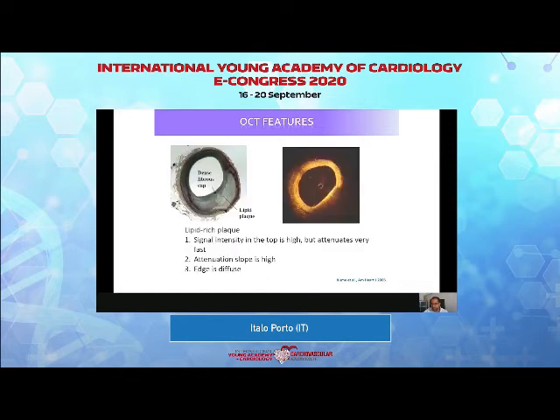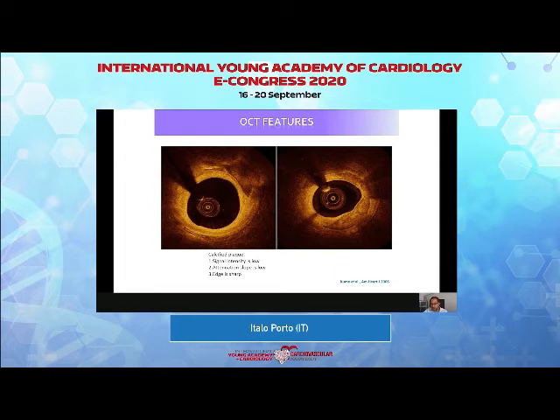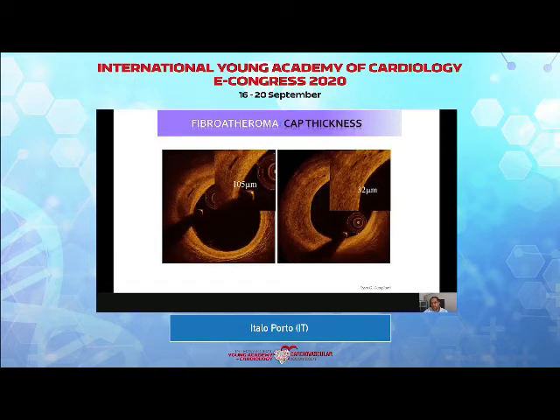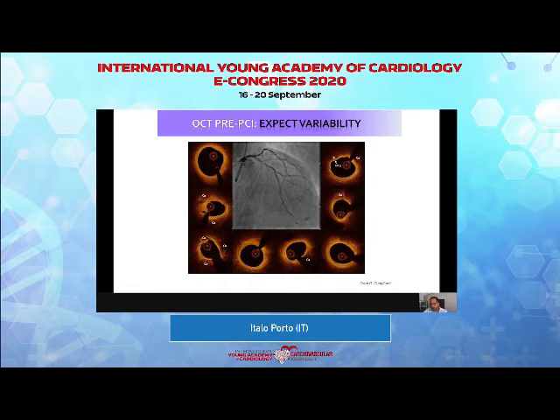Lipid-rich plaques are characterized by very fast attenuation, a bright top, and you cannot see the edges. With calcium, you see the edges quite clearly — sharp edges, low signal intensity — and the signal does not attenuate as fast as in lipid plaques. You can identify and measure fibrous cap thickness in plaques, but in most patients you see all these features combined in a single image.